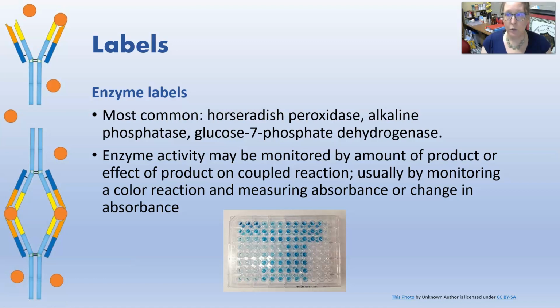We're going to look at labeled immunoassays. Alright, so a quick review over the labels. The labels can be of different types. They are affixed to the antibody, or detector antibody, or whatever signal we're trying to pick up, to emit the signal. They're done by the manufacturers. So the enzyme labels are the most common, although it's really actually gone more fluorometry and chemiluminescence.